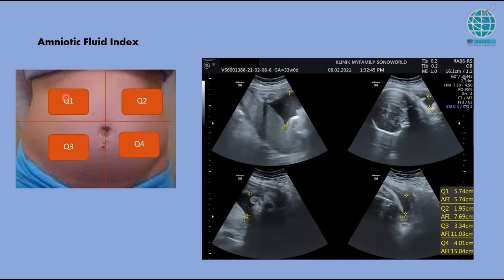Choose quadrant 1 and, with the probe parallel to the maternal spine, do all 4 quadrants. On your machine you may have a 4-quadrant image layout — I like to choose that and select all quadrants. We measure at the largest area where there is nothing in the AFI. The machine will sum up all your measurements: quadrant 1, 2, 3, and 4 — and this gives a reading of 15.04 centimeters, which is normal.